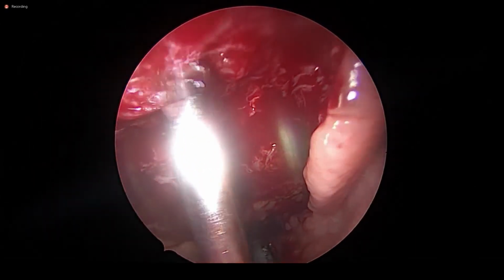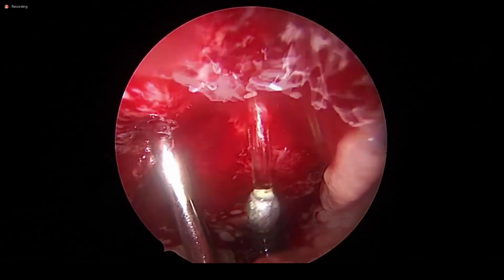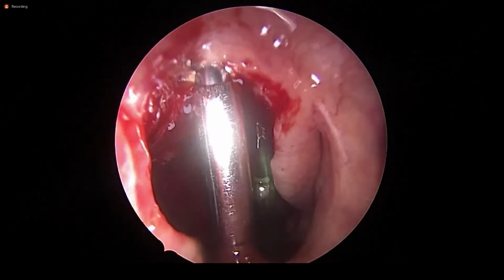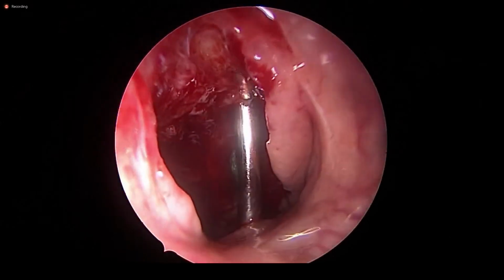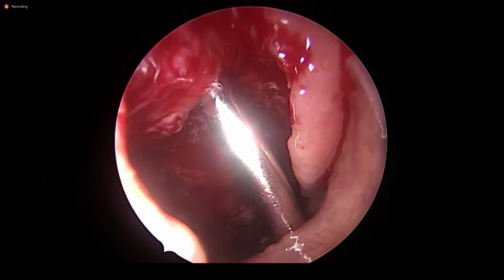This is the base occiput now. See, I can feel no muscles behind now as I go up. Only base occiput, and now here I can do hard combing. There is no muscle behind. Only periosteum, which is quite resilient. It cannot be cut by the micro debrider. See this? This is called hard combing.